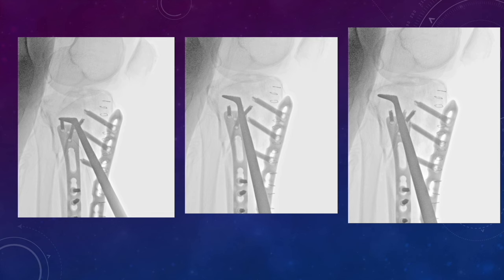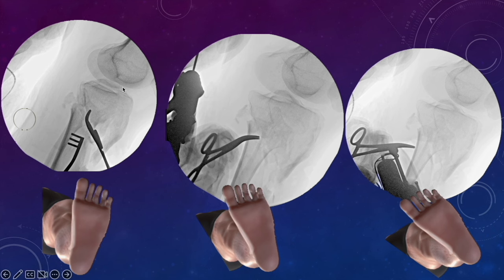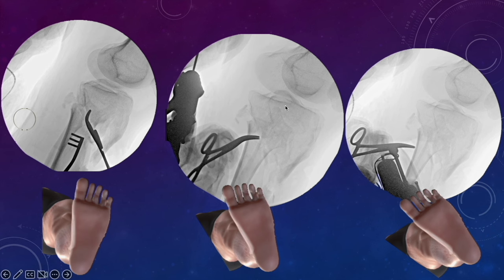The technique is simple. In a standard lateral view there is overlap between the lateral condyle and medial condyle. If you rotate the tibia internally, the medial condyle will come downwards while the lateral condyle will come upwards — the medial condyle moves to the posterior part while the lateral condyle comes to the anterior part. The fibula also moves anteriorly in the fluoroscopic view. By this technique you are able to localize the two condyles.